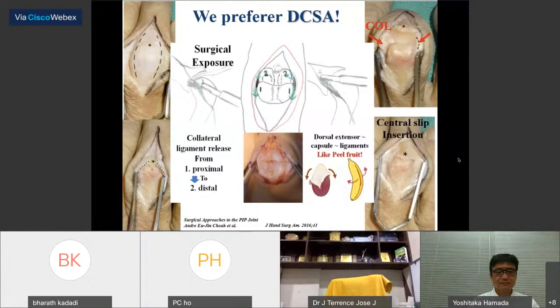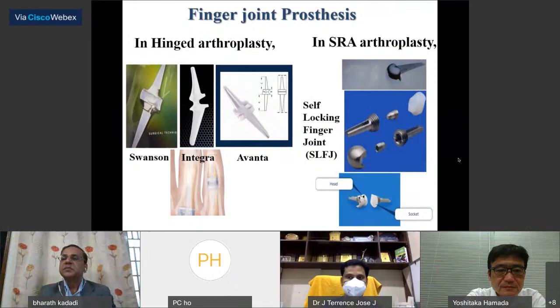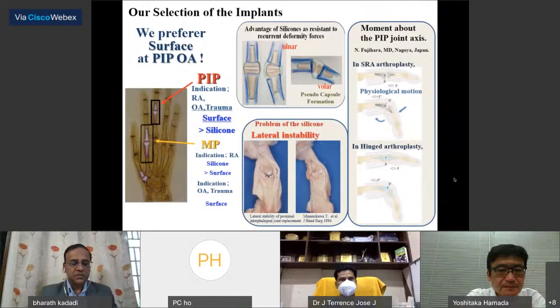In finger joint prostheses, there are two major types, hinge type and surface replacement arthroplasties. This slide shows my implant selection. Even in the affected PIP due to OA or trauma, silicone is widely used due to its convenience and stable short-term results. I would like to show that surface replacement is excellent due to its physiological motion with stability against lateral stress.